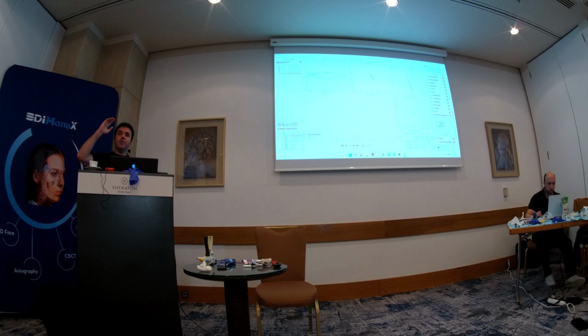Never do axiography with the patient's head on a headrest, because you lose part of the diagnostic. Right? So now I see this coronally, so I know that is cervical, that is exactly the same point. And then for that point, the patient starts to close, trying to get to a good position, but the disc is displacing here.